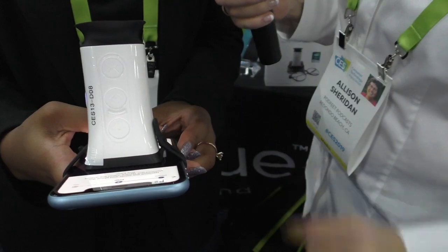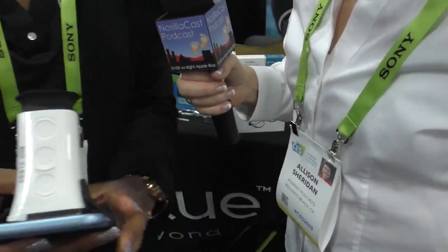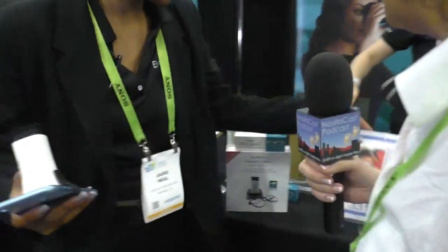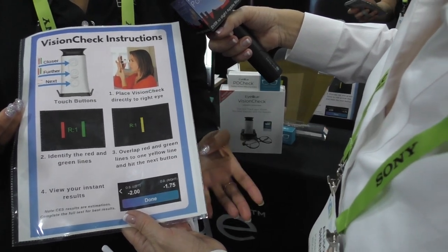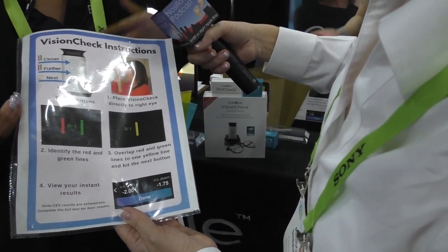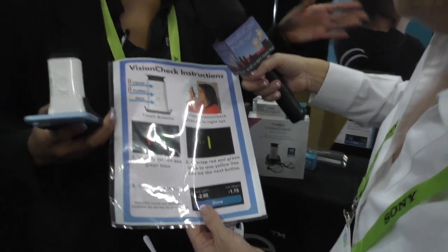Now it's sticking out at 90 degrees from the screen. Do I have to keep the glasses on? No, you can take those off. You're going to see a red and a green line, and your goal is to overlap them to make one yellow line. Once you do that, hit the next button on the device and it'll rotate — you do that several times on your right eye, then several times on your left eye.